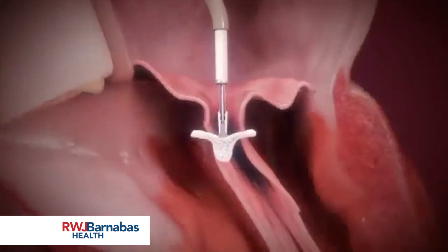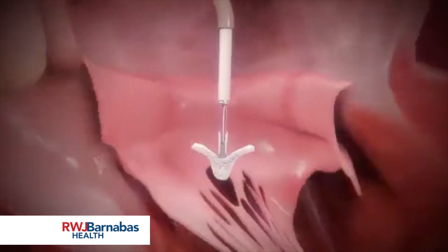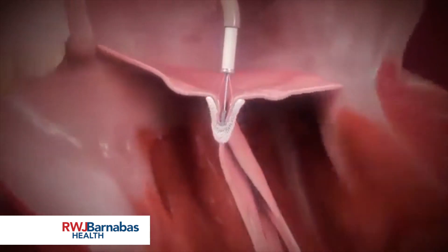The clip is advanced into the left ventricle below the valve leaflets and retracted to grasp the leaflets. MitraClip grippers are designed to drop firmly into the clip arms, securely capturing both leaflets.